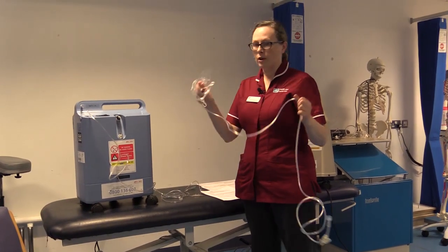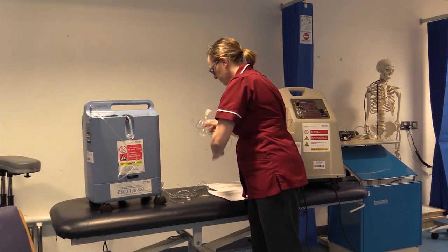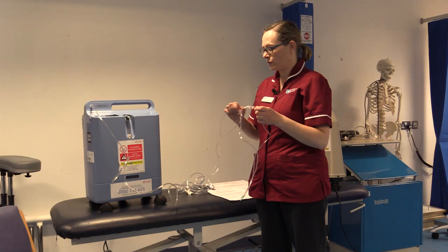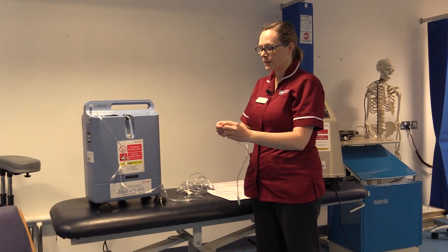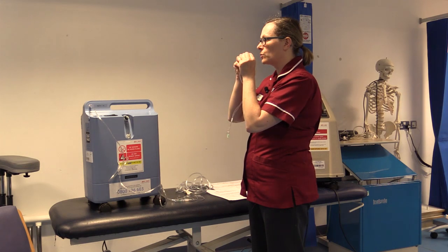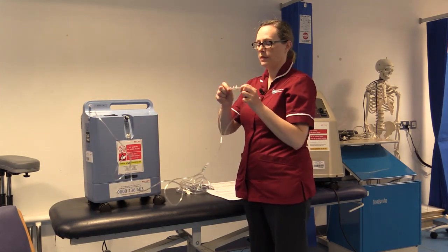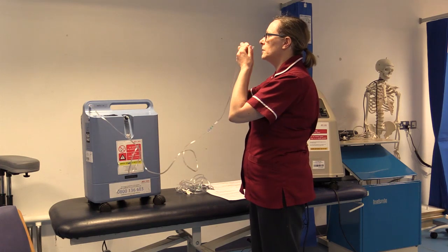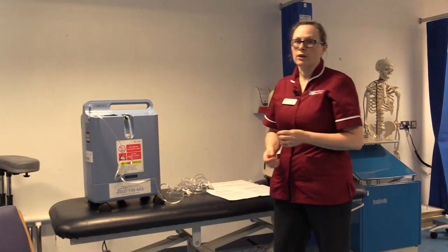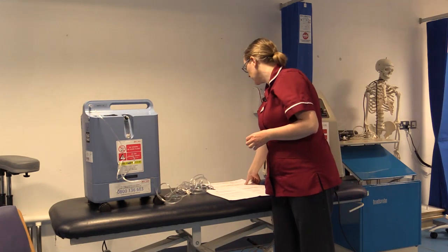One method may be an oxy mask, which is attached to the concentrator. The other will be nasal cannula or nasal specs, as they're known. There's 2 types. One is curved, and the curve goes towards the lungs. The other type has got a lip, and we will put that in the patient lip to lip, and we'll be using them shortly.